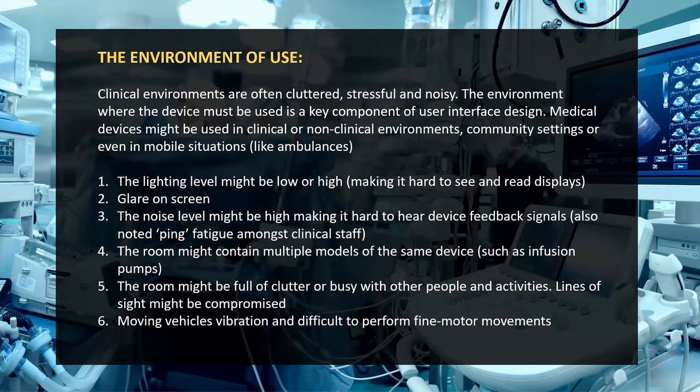So there are some things which we've talked about. These environments are often cluttered, stressful, and noisy. You've got to find a way of making the device that you're designing fit into that environment and be useful. There can be some counterintuitive things, like the lighting level might be too low or too high. If it's too high, you quite often have problems with reflections on displays and the glare on the screen. The noise level might be high, making it hard to hear device feedback signals.